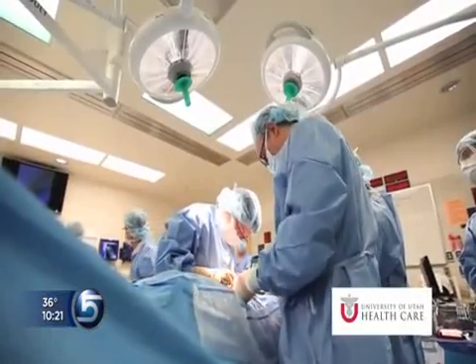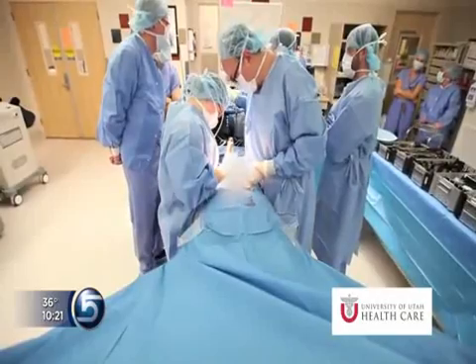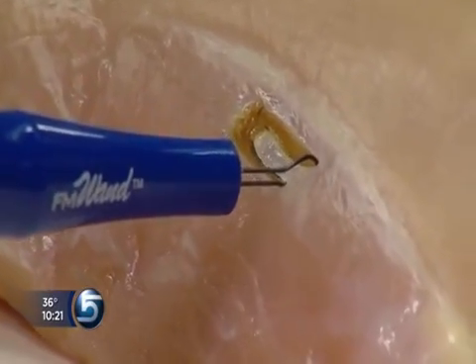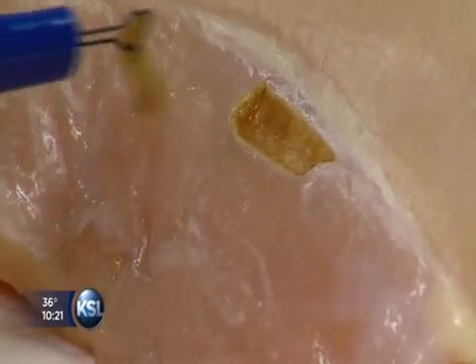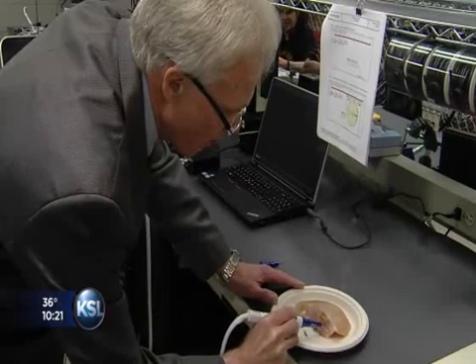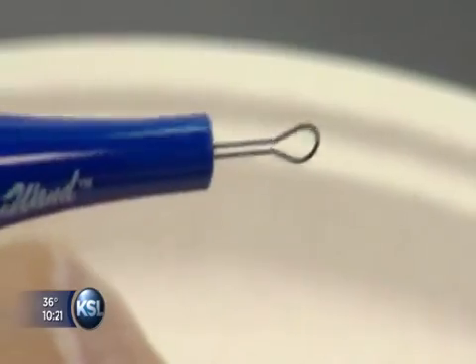Reduce time in surgery, lower risk for patients, less scarring and faster healing and recovery. The wand easily cuts like a scalpel or, with a change of the tip, scoops out tumors or unwanted tissue. It senses automatically how it's being used and even uses flash heating for self-cleaning. This is the key goal: the surgeon is there to solve a problem and leave the least evidence that he was ever there.